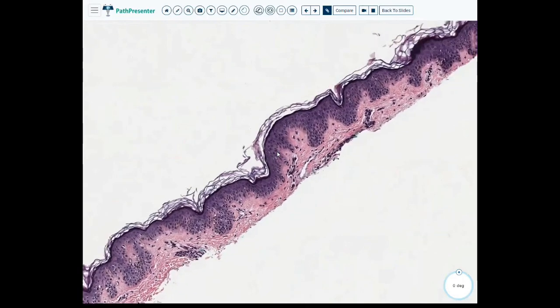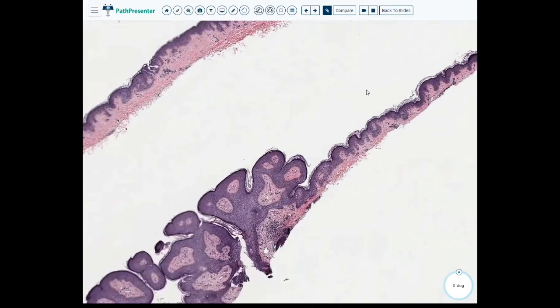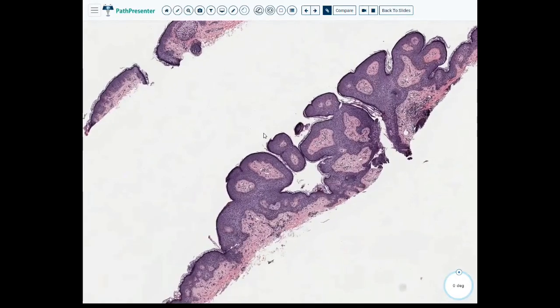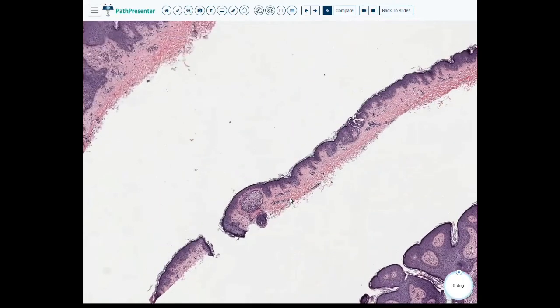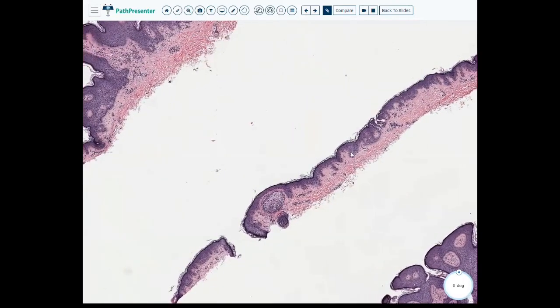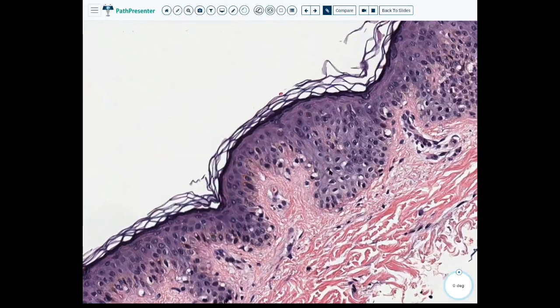So for this, I would probably just leave this as an acquired nevus junctional type, or just a junctional nevus. This has likely been here for quite a while. Looks like, again, maybe a small nest here. Okay, but everything's in the epidermis, so just a junctional nevus. If someone wants to add anything to this, we'd be happy to learn more about this, or just to see everyone's thoughts.